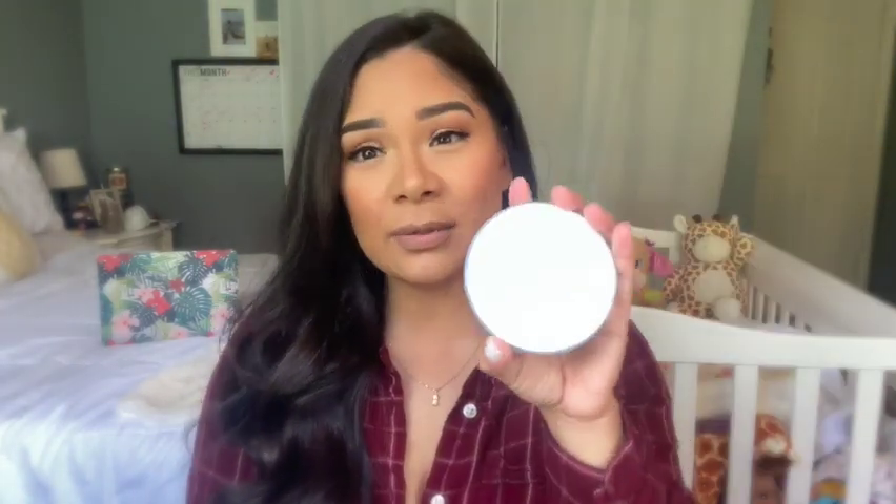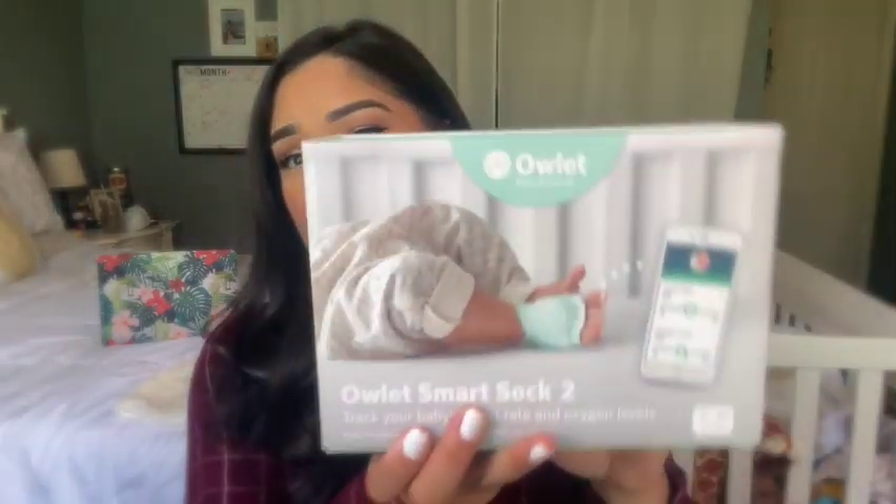On the base station, a few different light colors indicate different things. White means the monitor is charging. Green means it's connected and getting readings. Note: if your baby is wiggling it won't get an accurate reading — I've heard the Owlet Sock 3 handles movement better. Yellow means the sock placement is off or the baby has kicked it off, and it will alert your phone and play a lullaby.